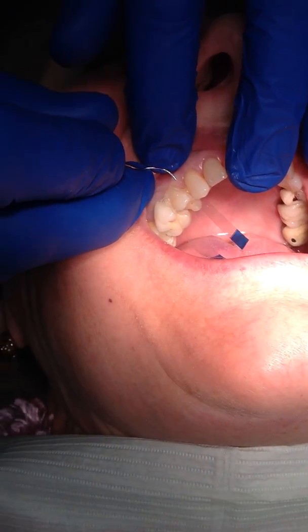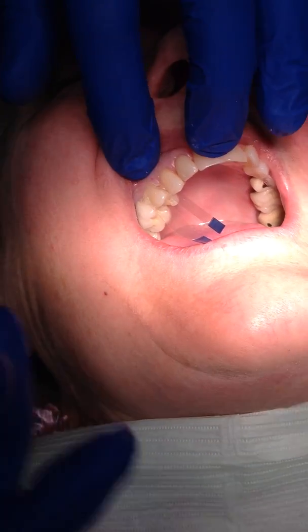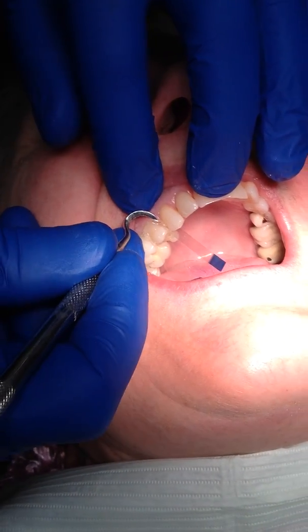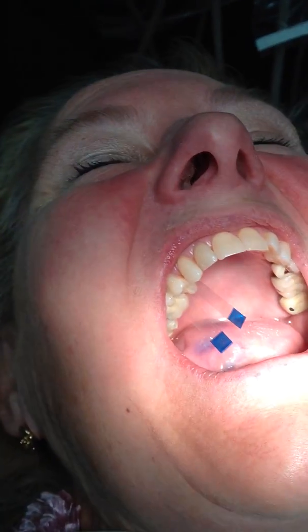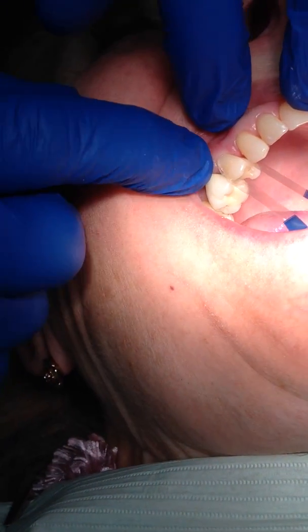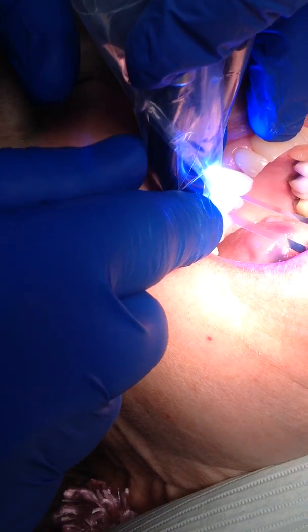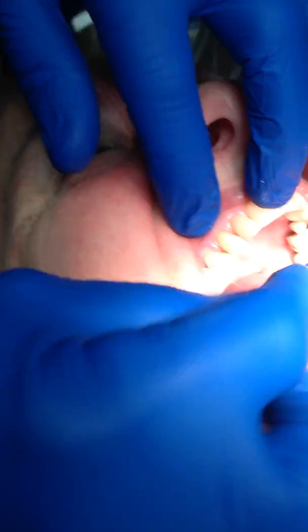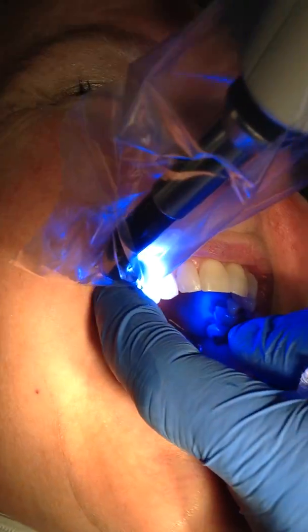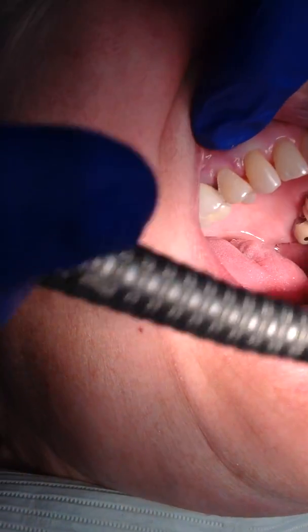Now that we've reached an initial cure, I can actually take the matrix off. I use an explorer, or if it seems more stuck, I'll use what's called an amalgam knife — but a spoon or any other instrument will work. And this just comes off very nicely. Before we finish it, I want to cure the gingival aspect because it didn't cure as well since it was being covered. This is especially important if you're using a colored flowable resin. Take the band off.